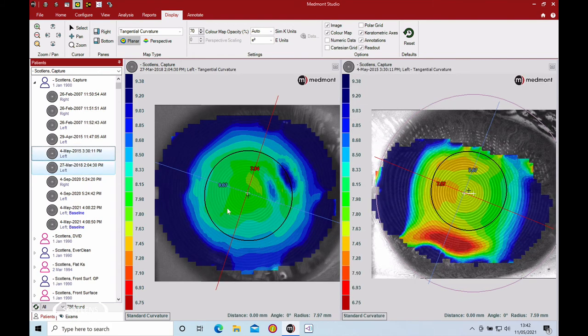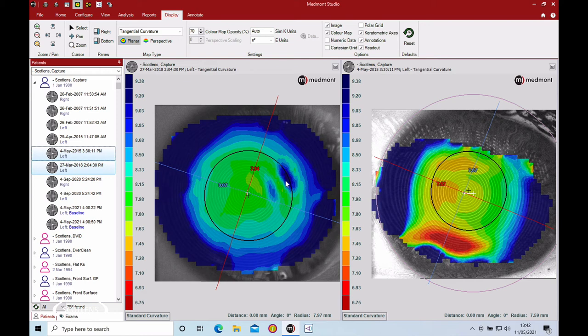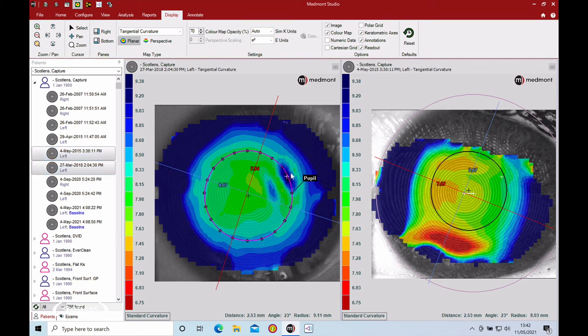These two images, you can see we've got what we thought was a nice big capture, but we've now got a bit of interference. This is when you look at the tangential plot map and see, are we dealing with a good quality map in a normal cornea? You can see we've got this blue area on the left image.